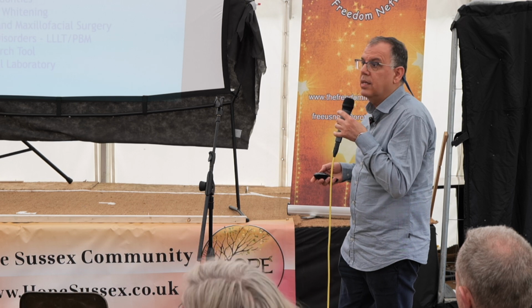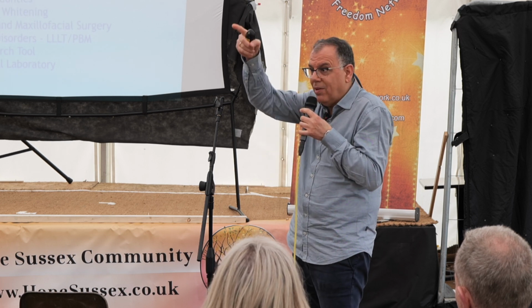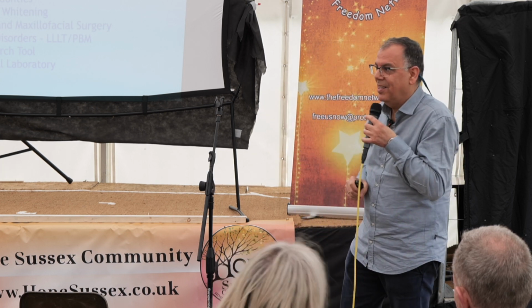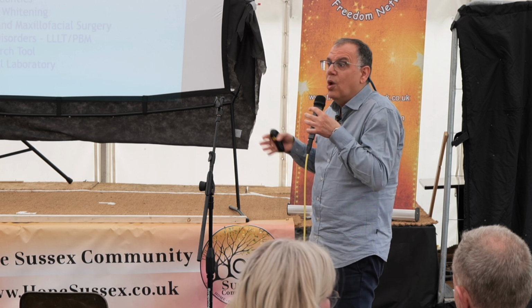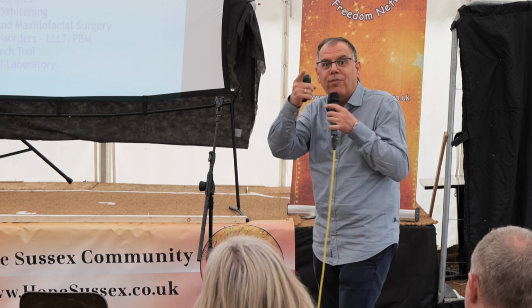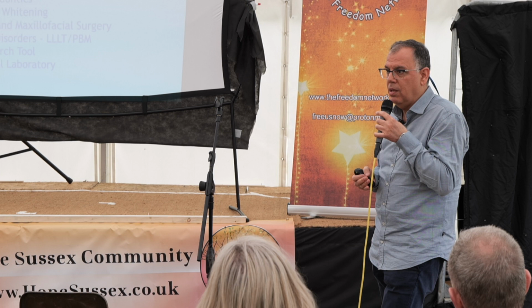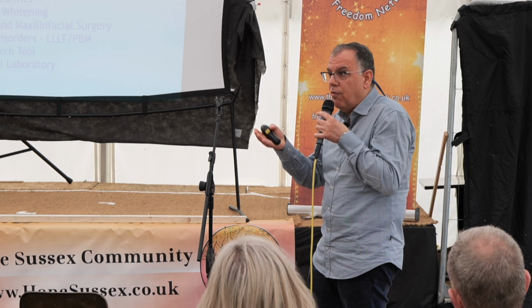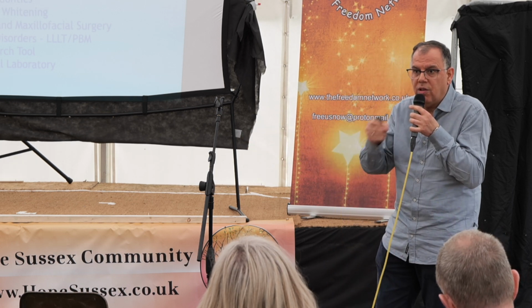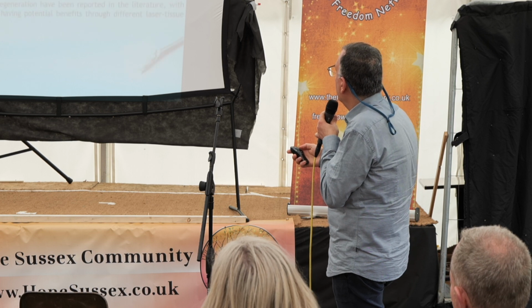Bacteria. Yes. It's killing the bacteria, irradiating all around the tooth, the apical part of the tooth, lateral parts of the roots, all around, the periodontal part, as we said, and this will sterilize the bone and stimulate the stem cells to proliferate to a new healthy tissue around the tooth. So treatment of gum disease with laser will regenerate the periodontal ligament, the whole healthy tissue around the tooth. Okay? And research tools and dental laboratory tools as well, we could use the laser.